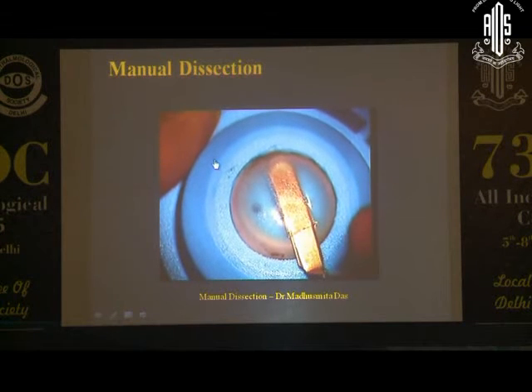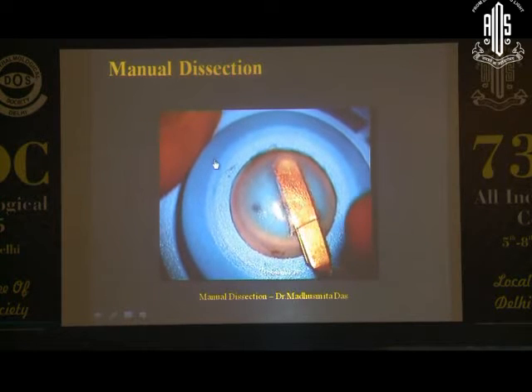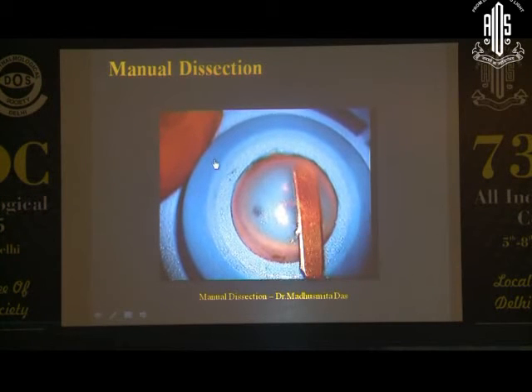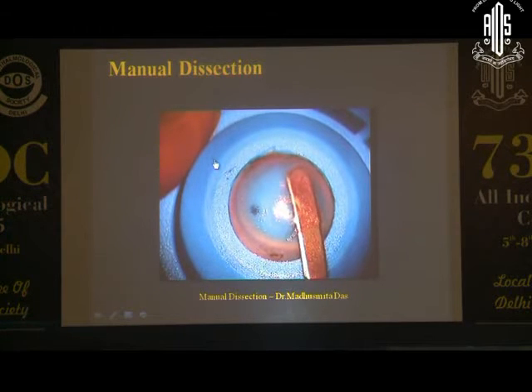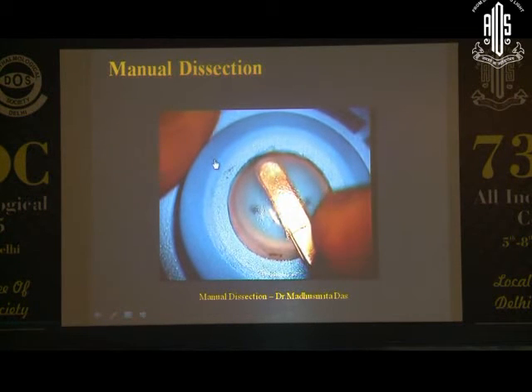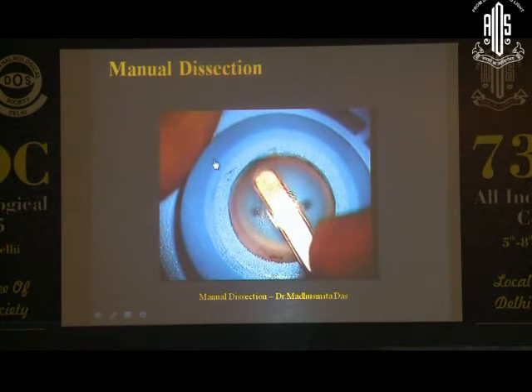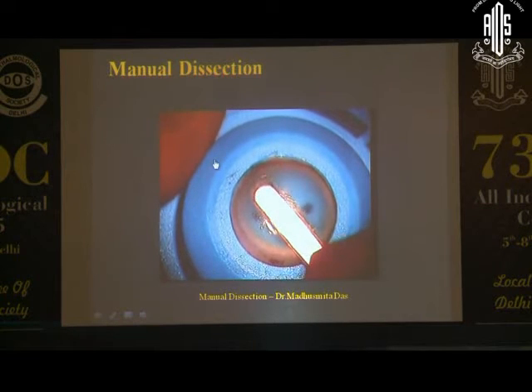In fact, surgeons also use two different dissectors for this kind of dissection. One is a straight dissector, and then again a curved one. Like demonstrated in this video, using only a curved one, you can achieve a good lamellar dissection. However, practice needs to be done in the wet lab before proceeding to use these kind of eyes in the surgery. So the dissection is carried out and then it is completed in all the 360 degrees.